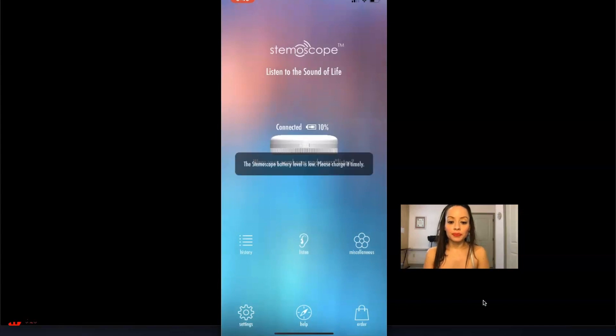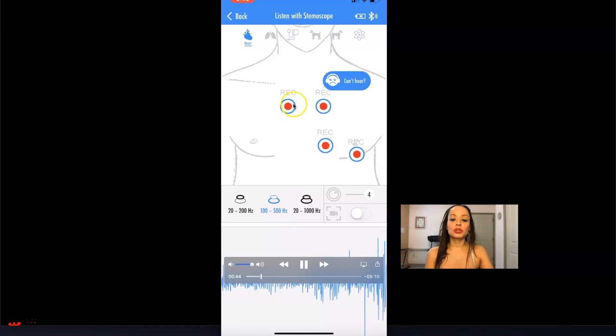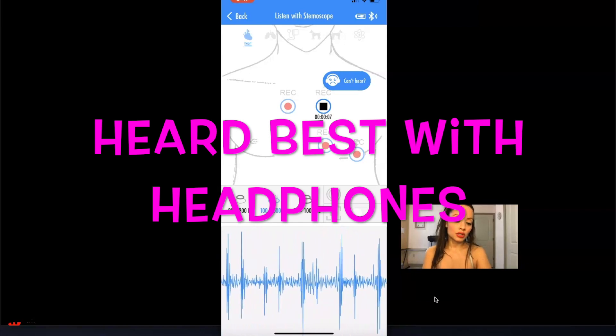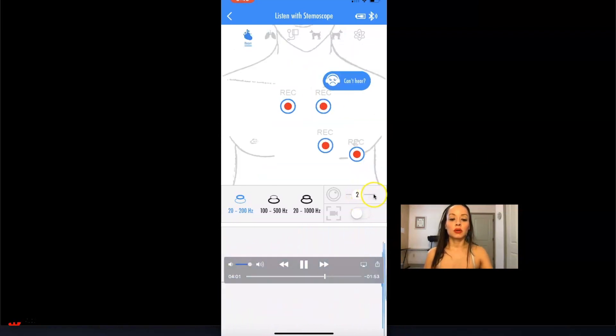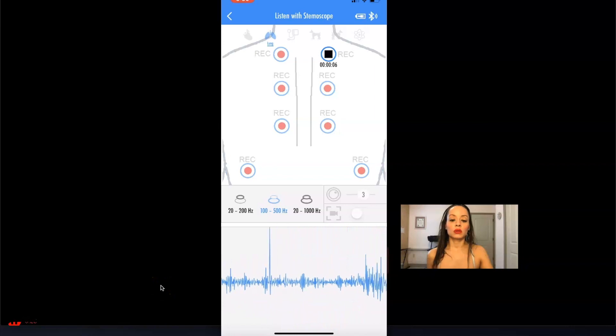Here's a quick video I recorded about the Stemascope. This is what the app looks like. You turn on your Stemascope and press one of the keys to listen. You press listen, and the app is really phenomenal — I really liked it. Then you select which hertz you want. You can hear the actual heartbeat, and then you can change it to lungs. You can also change it to blood pressure or animals. You can adjust the volume up to four. And those are the lung sounds.